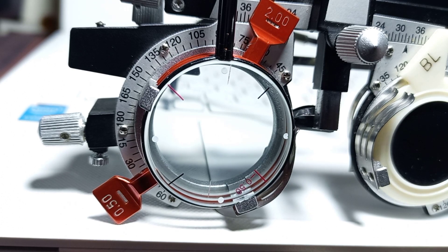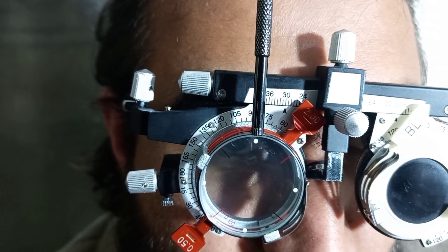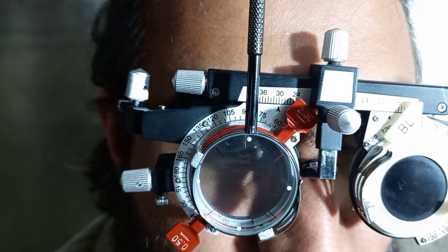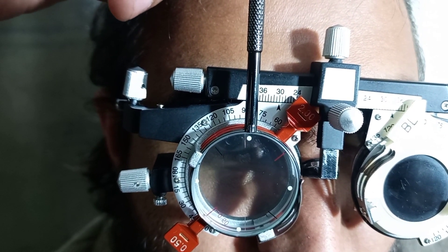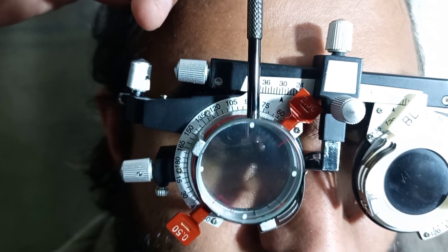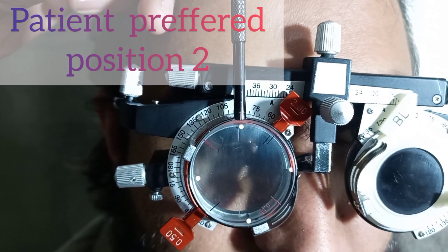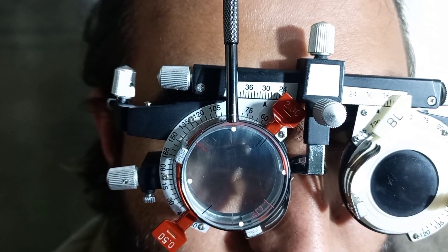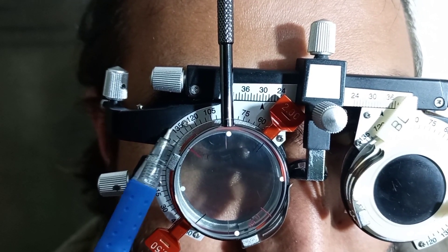Now we are in the testing room. We will ask the patient: can you see the line? Yes. Now tell me — is the line clearer, darker, and sharper at position number one, or now at position number two? It's clear at position number two. Position number two is when the minus line is coinciding with the 135 axis.